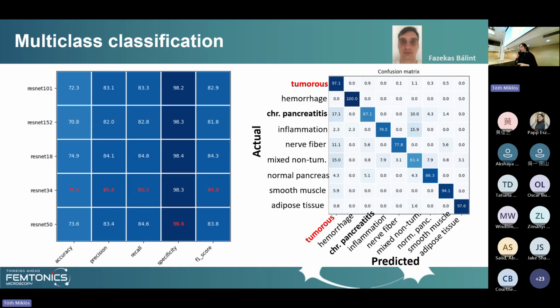This is a more difficult task because real-life tissue is heterogeneous, and this means that a single tile may contain mixed components. Nevertheless, multi-class classification is still important because it moves the analysis closer to real histopathological interpretation, where the tissue context also matters.